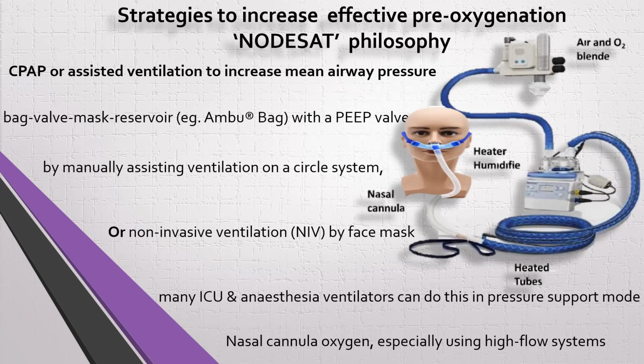And as we all know, many ICU and anesthesia ventilators can do this in pressure support mode. Also, a high flow nasal cannula can provide some sort of CPAP.